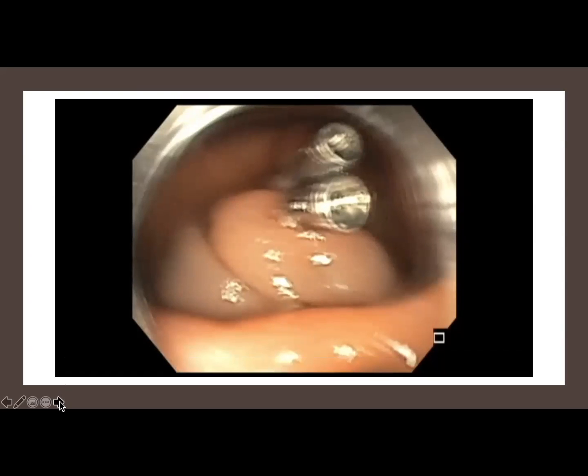So what I actually left here is because there are lots of points to learn. This was an 8 millimeter lesion that was hot snared in somebody where the endoscopist had a tough time going through the sigmoid colon because of diverticulosis. And I think that's one thing to keep in mind, right? When you have a difficult insertion, your access to the lesion may not be complete or easy.